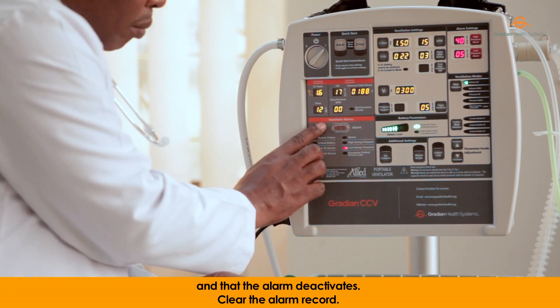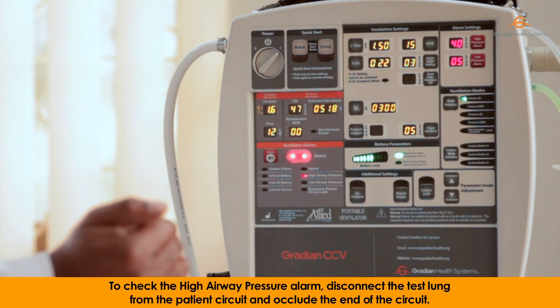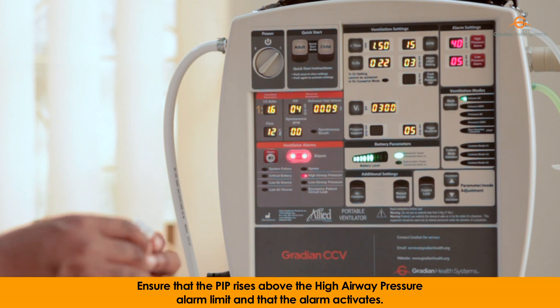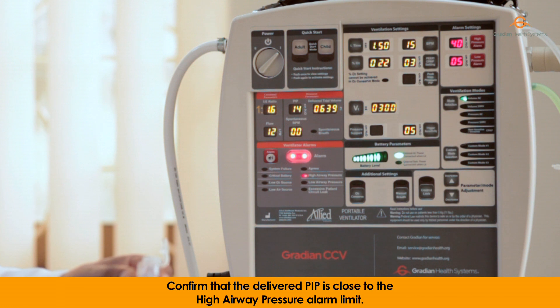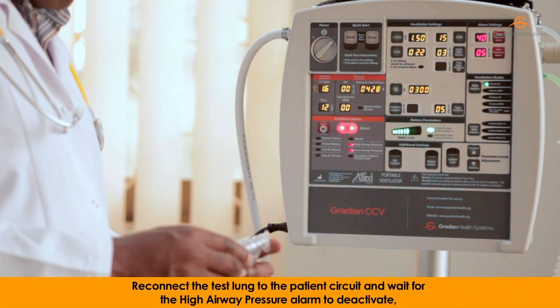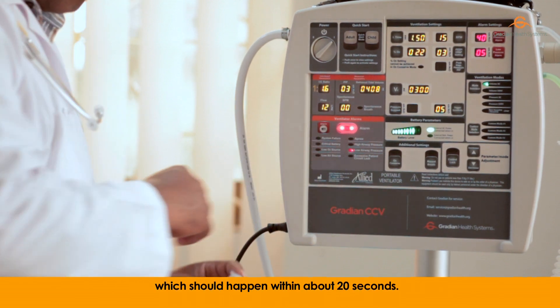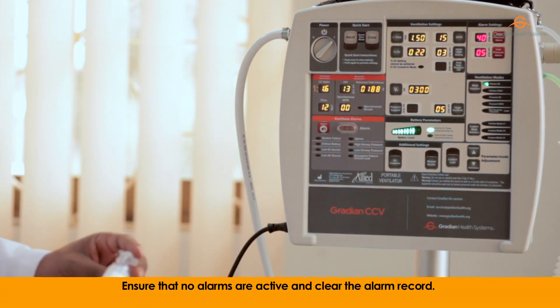Clear the alarm record. To check the high airway pressure alarm, disconnect the test lung from the patient circuit and occlude the end of the circuit. Ensure that PIP rises above the high airway pressure alarm limit and that the alarm activates. Confirm that the delivered PIP is close to the high airway pressure alarm limit. Reconnect the test lung to the patient circuit and wait for the high airway pressure alarm to deactivate, which should happen within about 20 seconds. Ensure that no alarms are active and clear the alarm record.